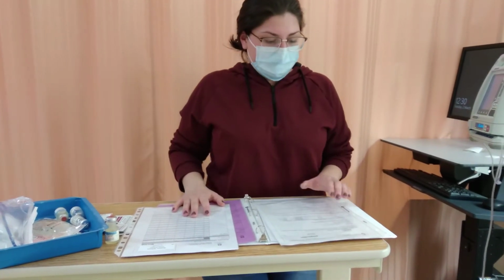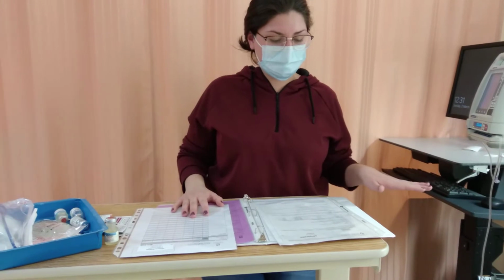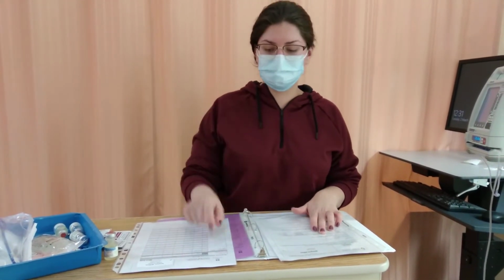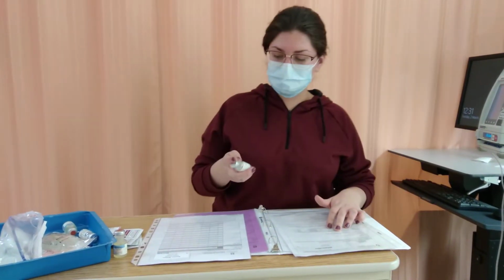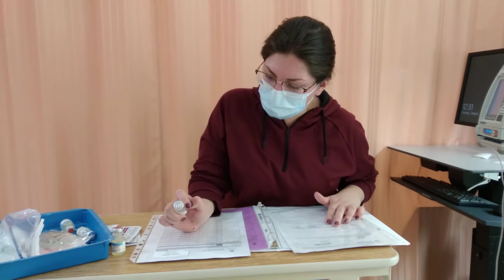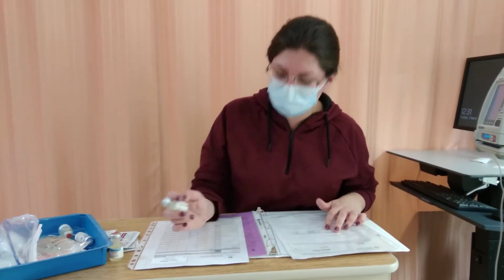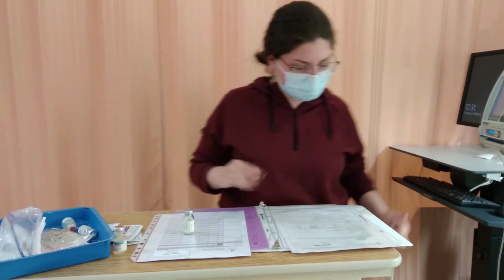If we're giving it every 4 hours, that's 6 times a day, times 1 gram, so that's 6 grams, which is fine for us. Okay, so it's supplied as a few different doses, and we've chosen the 1 gram, which suits our needs perfectly. So here is our vial. Okay, so ampicillin, 1 gram every 4 hours, and the time is now, IV.